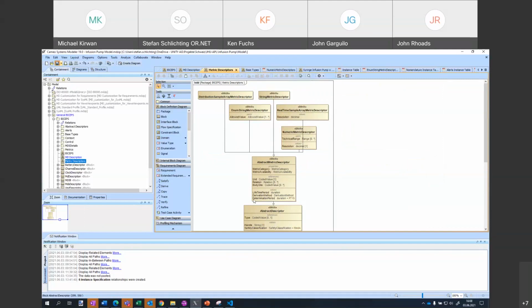So I put in the BICEPS model with all its attributes, or maybe not all, but all that I needed so far, so that I can create a syringe infusion pump. And of course, if you have any questions in between, just please ask them.